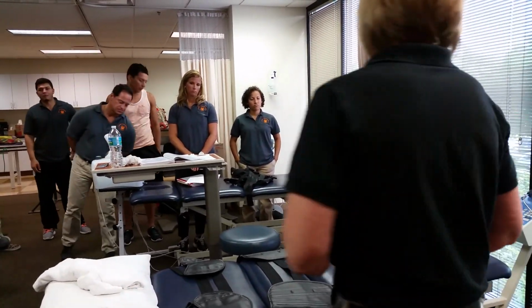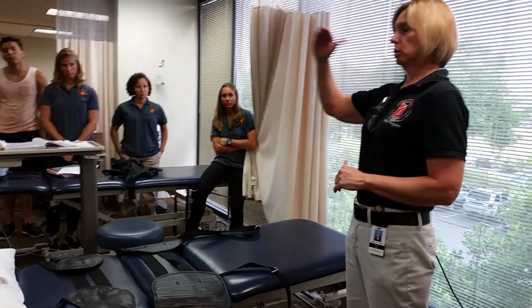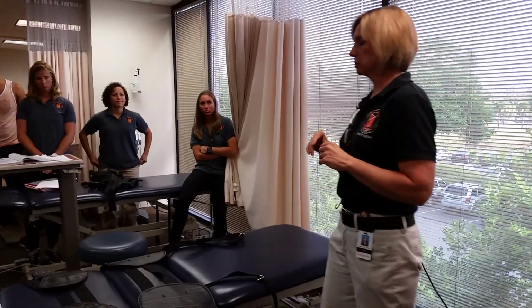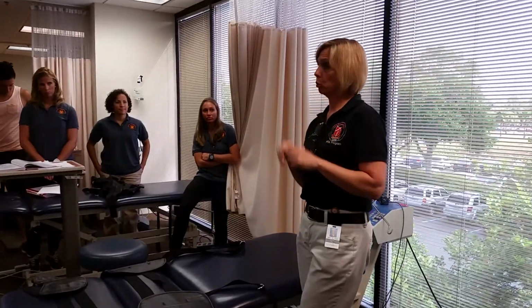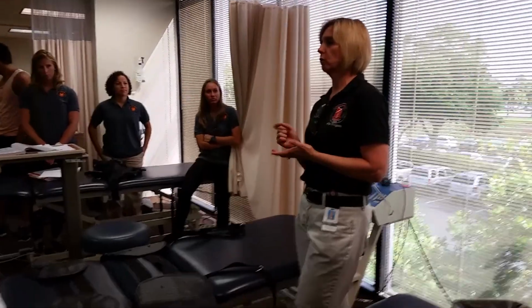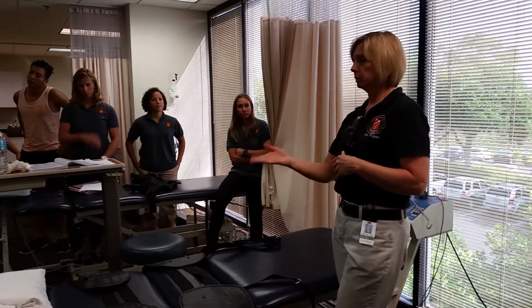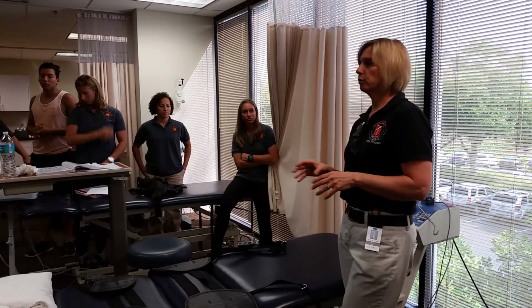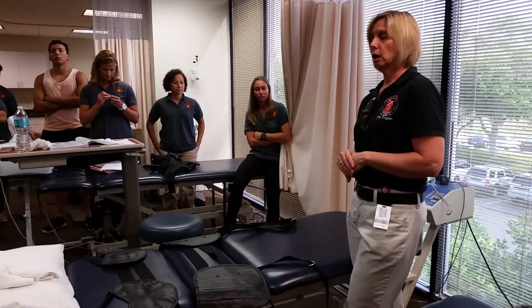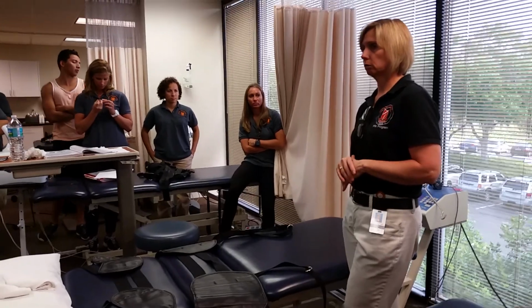Okay. So any questions on the procedure? There is a lab sheet that actually walks through the procedure of how to, the order to do things in general. I'm not as crazy about the order. You'll see that there are like 20 steps. That was the original sheet that I wrote down from Dr. Z. So yeah, in general, make sure before you start the traction, they're in the right position, the pads are in the right position, on the table where the split is, and they have the switch, and the parameters are correct. Okay, then you can hit start.